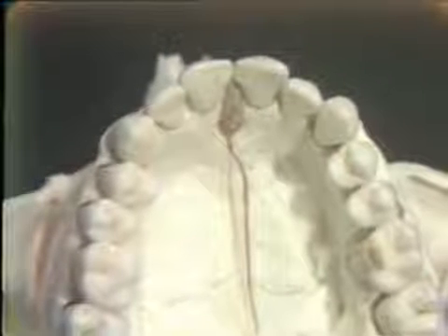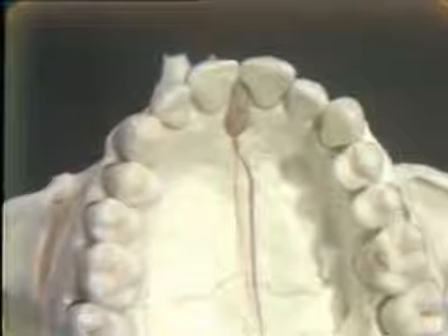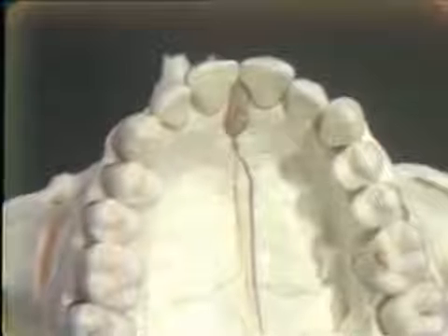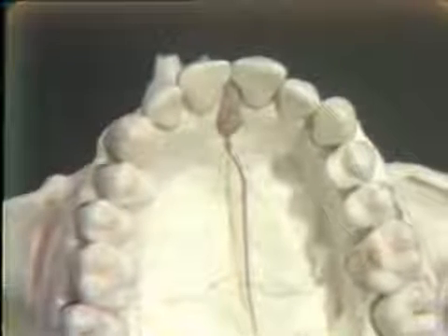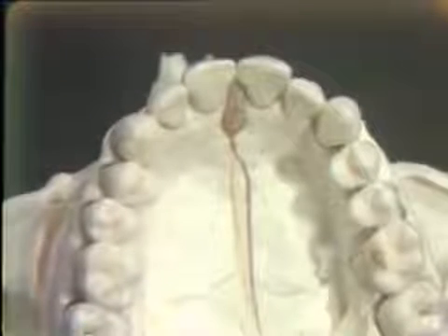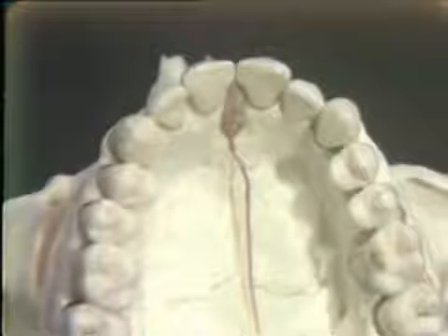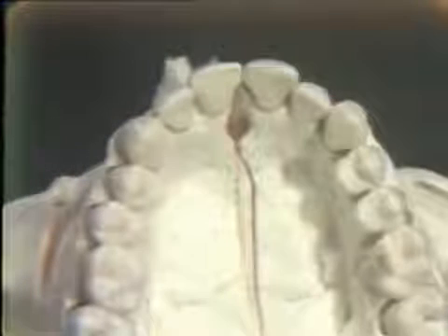As you look in the mouth, you will see that there is a papillae that overlies the incisive foramen directly over it, and we wish to avoid injecting directly into it since it is extremely sensitive to do so. So we find that it's adequate to make the injection on either side of the foramen and or the papillae, and we can very adequately anesthetize the terminal filaments of the nasopalatine nerve.